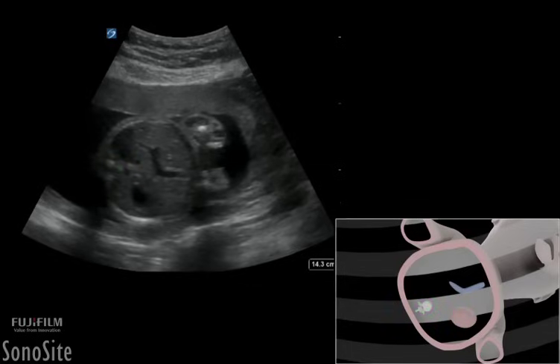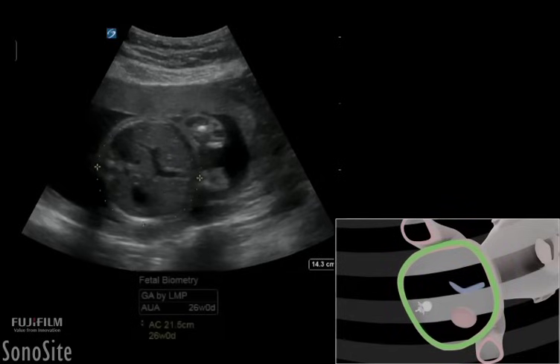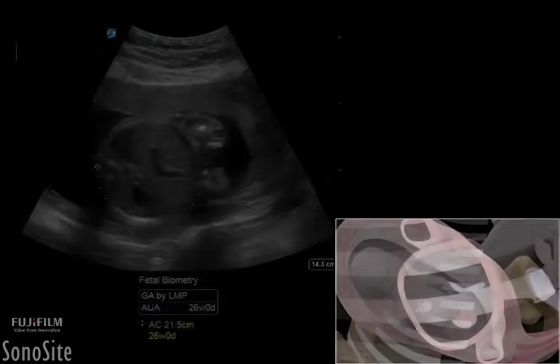The abdominal circumference measurement is performed in late pregnancy to reflect fetal size and weight rather than age, and is done by placing calipers on the outer skin surface of the circular abdomen and employing the ellipse measurement feature.